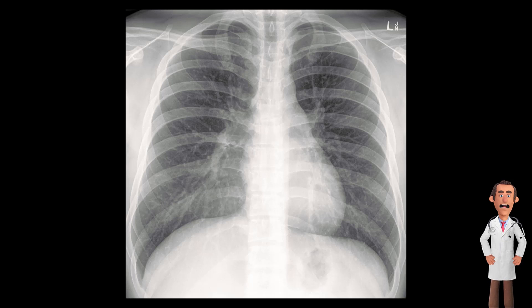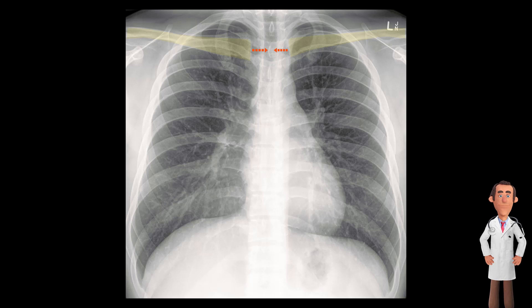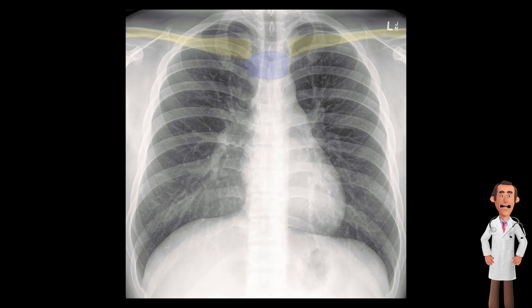Next, moving on to the bones, starting with the clavicles. Both clavicles should be equidistant. This is important to notice, as it determines the rotation of the film. You can also identify the manubrium between the clavicles.